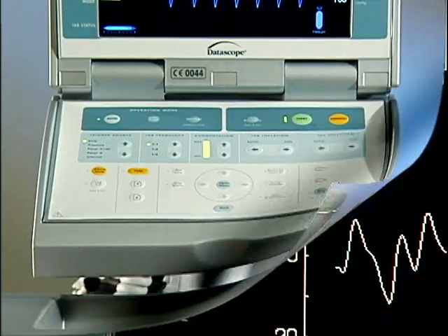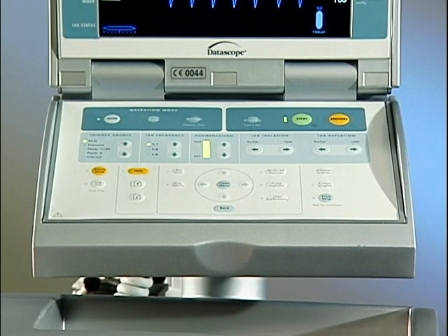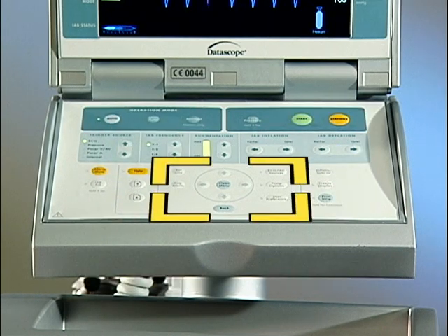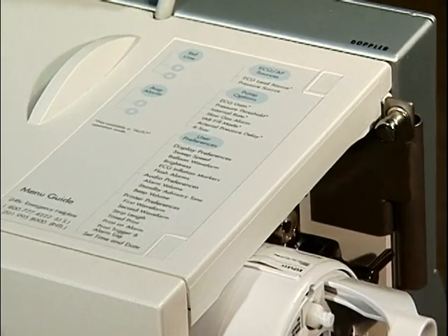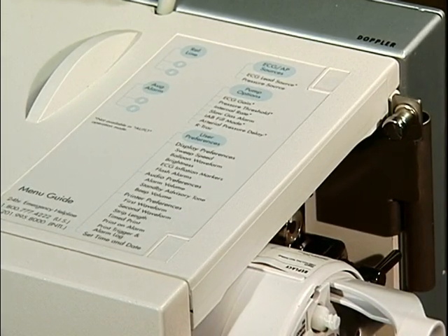The operation of any complex medical device always entails infrequently used functions, which may be appropriate only on rare occasions. Nevertheless, a competent operator must know that such functions exist and where to find them. The CS100 uses easy-to-navigate menus that provide rapid access to such infrequently used functions. All menus are accessed by pressing the menu guide key, shown here. Obviously, it's imperative when searching for an infrequently used function to find the menu that describes that function as quickly as possible. For this purpose, there is a reference to each menu and submenu located on the top of the pump console.